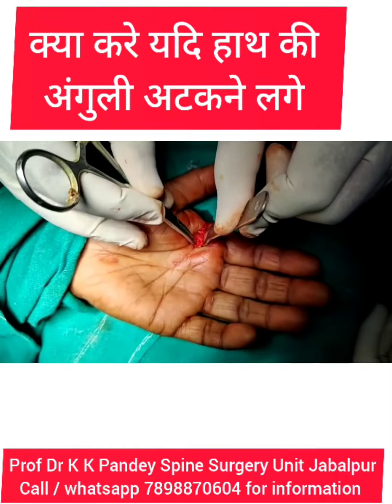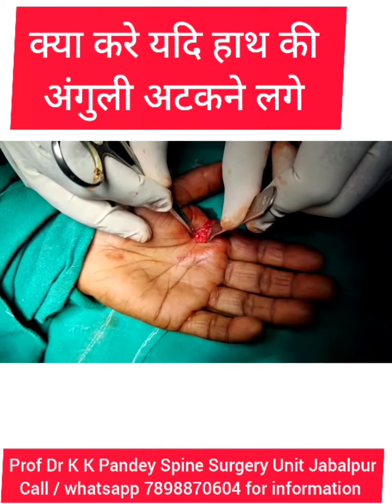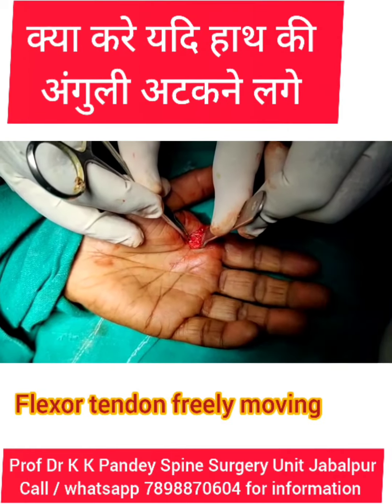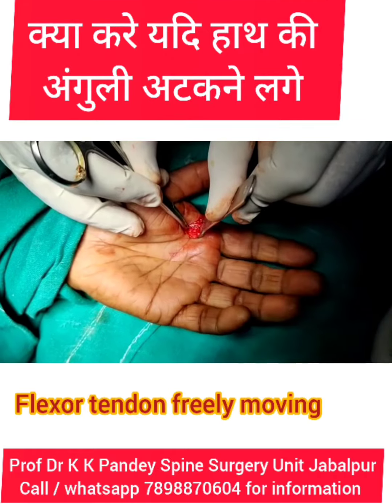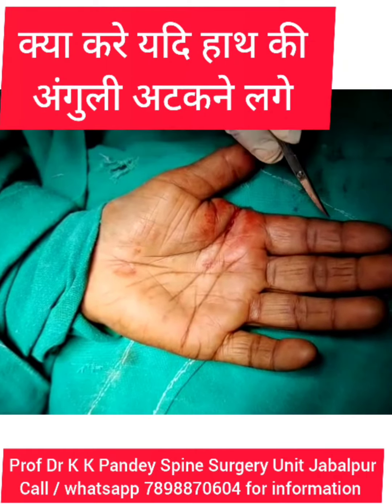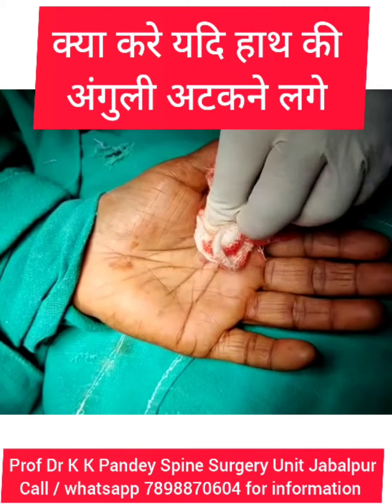Now see the flexor tendon is freely moving. This is the trigger finger in the index finger which is released.